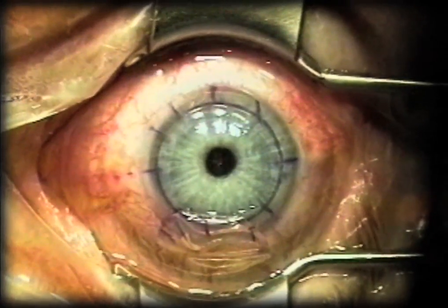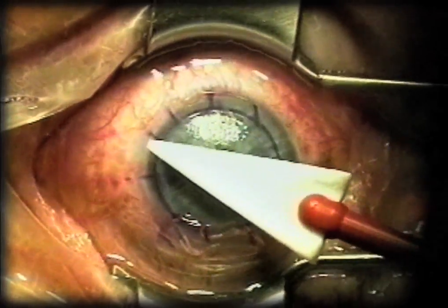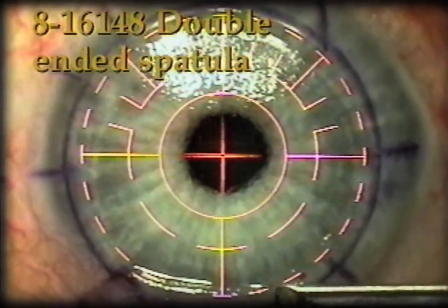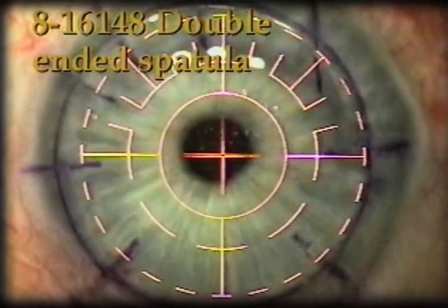The flap has been lifted out of place with the spatula. The thin end of the spatula is used to manipulate the flap. Now you can see it's sitting back down and you see the good alignment of those marks. Now we're going to see the speculum inserted once again.